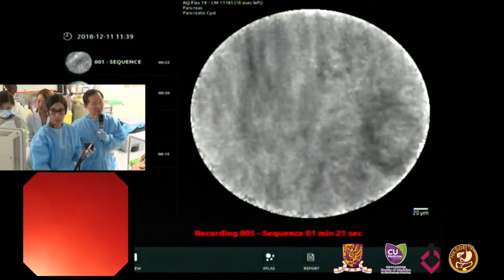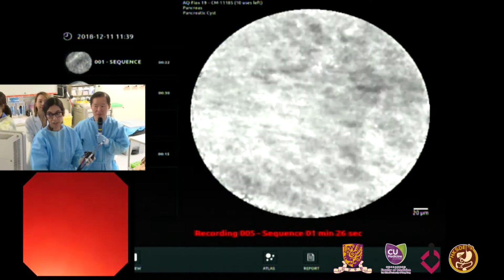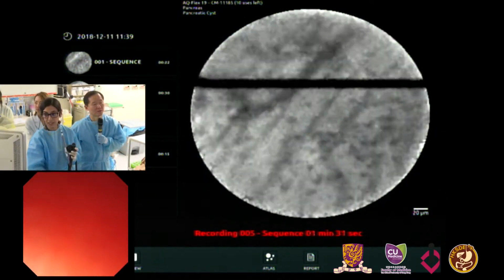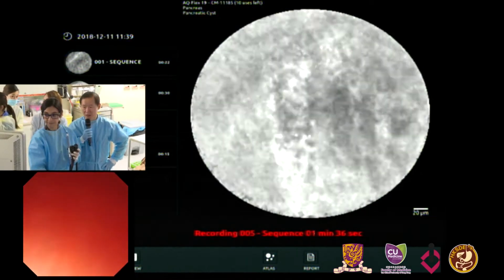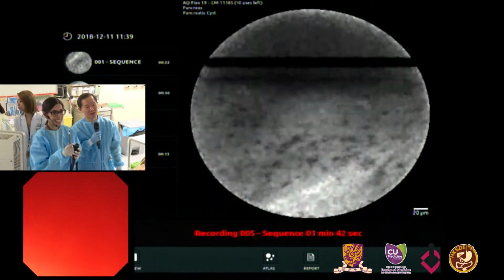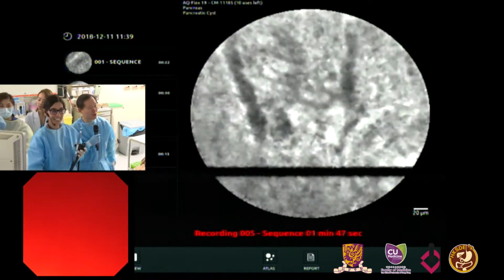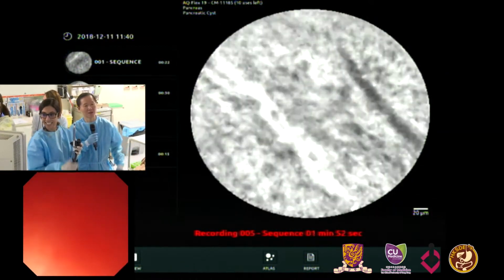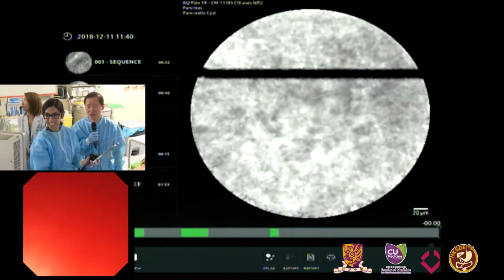And then at the end, we'll aspirate all the fluid out. I mentioned CEA, amylase, cytology I usually send, although everyone knows probably the cytologic yield is pretty low, less than 50%. Less than 20%, I guess, from my experience. If the cyst has a large mass, then the yield is high, but it's already obvious. But if the cyst is an ambiguous, indeterminate, oligolocular lesion, then the cystic fluid analysis does not generally give a good cytologic yield. So quite a disappointing cytology.